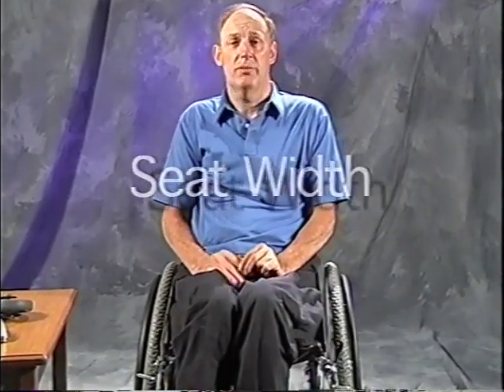Ideally, you want the chair to be as narrow as possible, not only for going through doorways and narrow spaces, but mostly so that the tires or the wheels where you're pushing fit underneath your armpits. And this will translate into a much better power transfer into the wheel. If you can get away with a 16-inch chair over an 18-inch chair, that alone is a 12.5% savings in energy put forth every time you're trying to push.